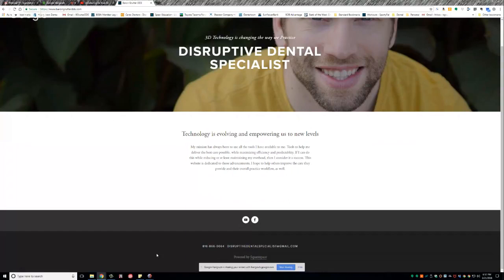What 3D printer do you use for the ortho IBT material? The only one I know of that currently has a profile built in the software is the Moonray, the Moonray S. So SprintRay, Moonray S.